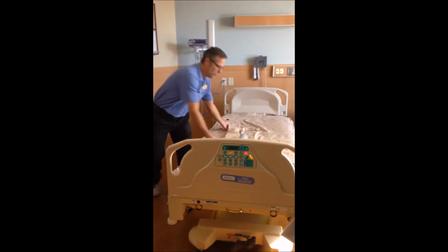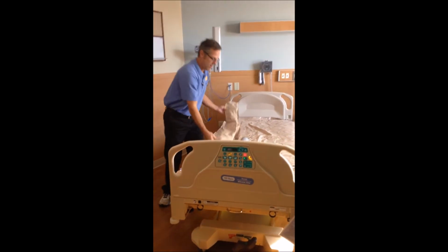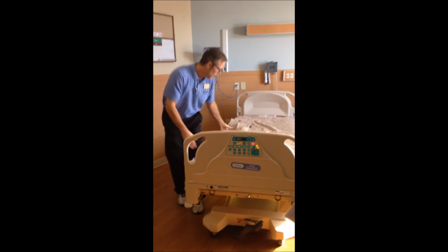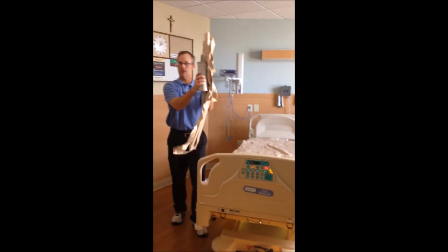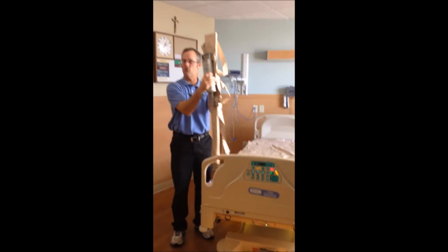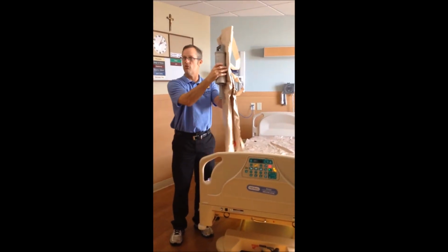Okay, this is the Waffle overlay. Your unit is going to be evaluating this product for treating and preventing pressure sores, pressure ulcers, for your high-risk patients. It'll come packaged just like this. What you see here should go home with the patient when they are discharged, for their continuum of care. This hand pump goes home with them when they're discharged.